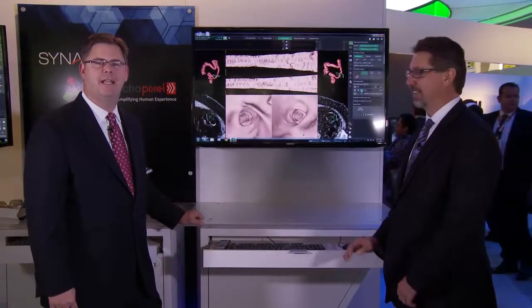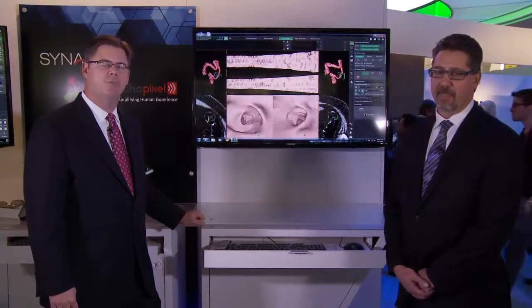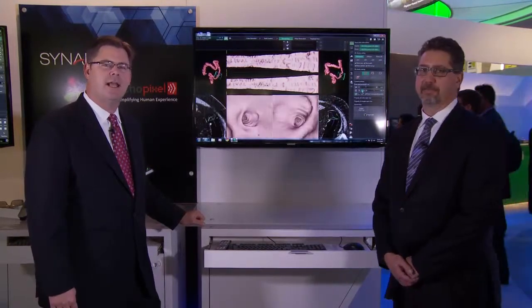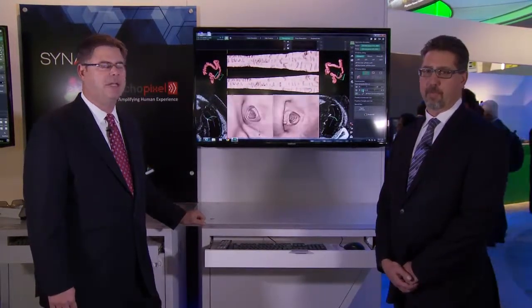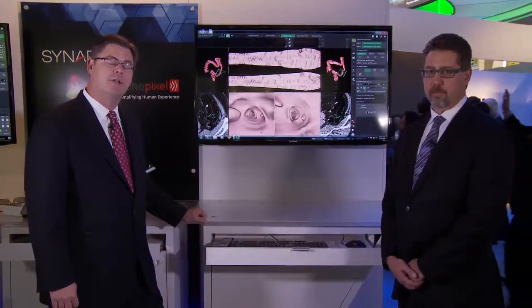We're now in the advanced visualization area, and we're highlighting Synapse 4.1 3D. I'd like to introduce Mike Siganowski, who's going to show you some of the new functionality that we're offering this year.